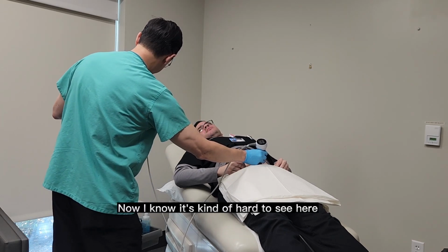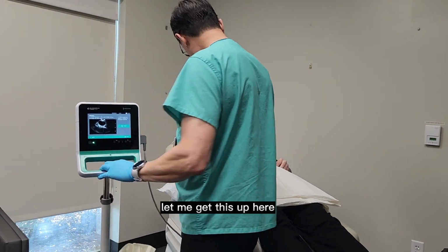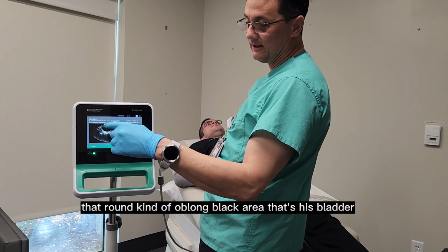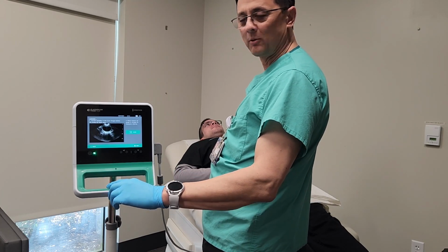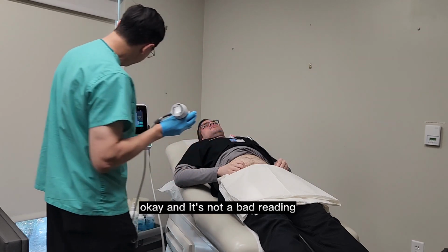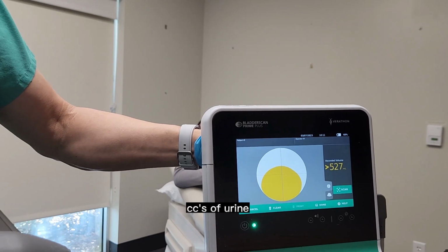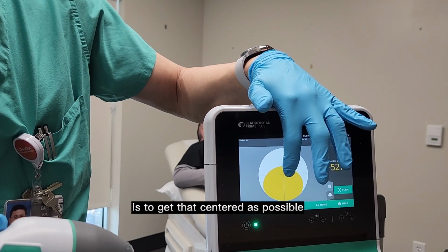I know it's kind of hard to see here, but let's see if I can show you this way. If you notice, we can see his bladder, that round, kind of oblong black area. That's his bladder, and that's where the urine is. So we want to get that centered before we push the button again. So let me get that centered. Okay, it's not a bad reading, a little bit low, but you can see he's retaining more than 527 cc's of urine. And what we want to do also is to get that as centered as possible.